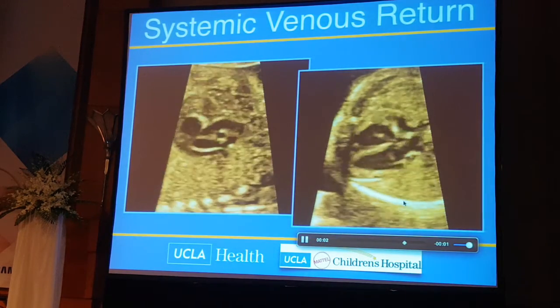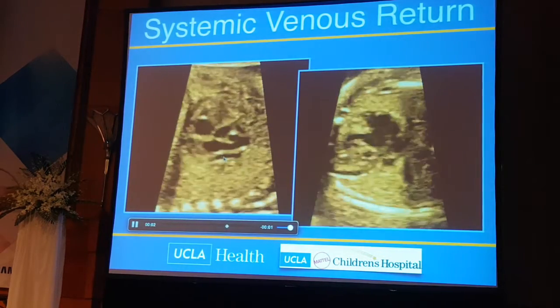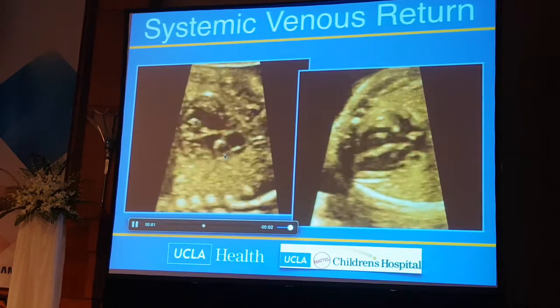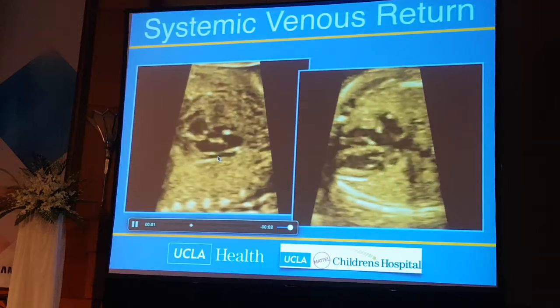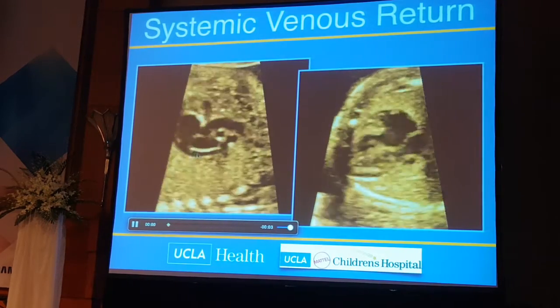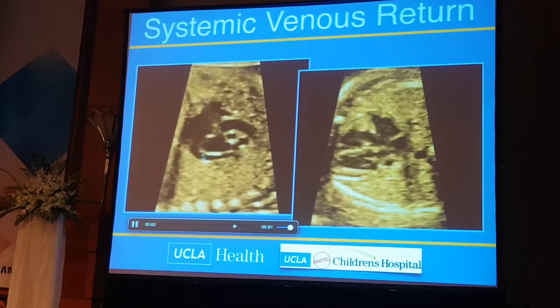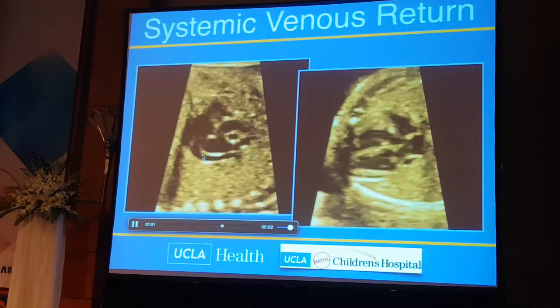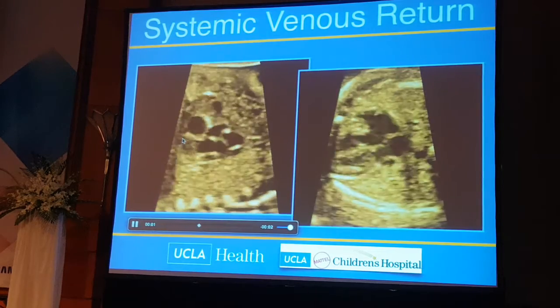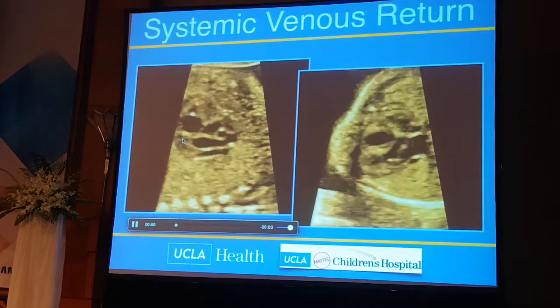This is a patient with a dilated coronary sinus, and it's dilated because of this structure on the left, which is what? So that's a left-sided superior vena cava, and if you image sagittally from left to right, you'll be able to see the left-sided superior vena cava like this draining into coronary sinus, and many patients will have bilateral SVC, so you keep on going towards the right and you'll see the RSVC.